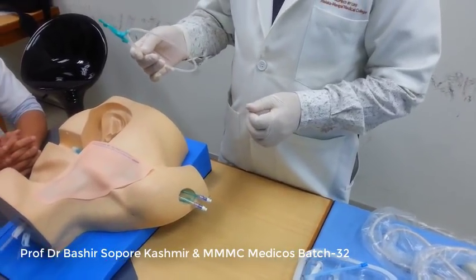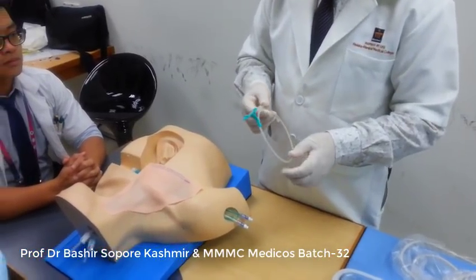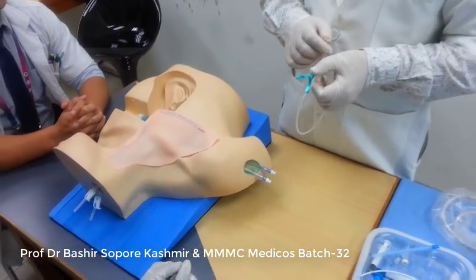Now the other item in the catheterization kit is this guide wire, right? This is a guide wire. Now what is this guide wire? This guide wire is J-shaped. This is called a J-shaped guide wire.